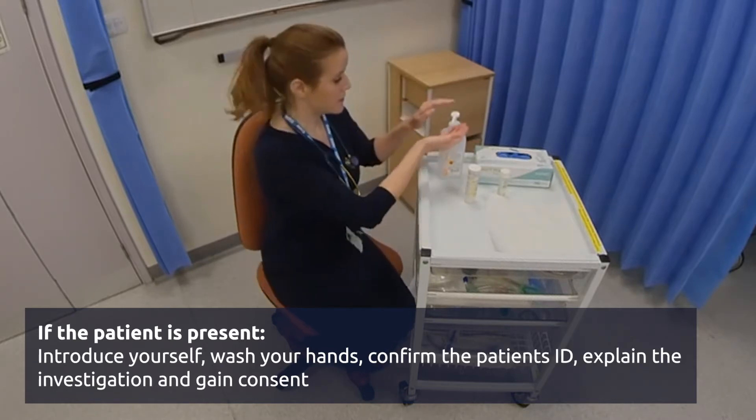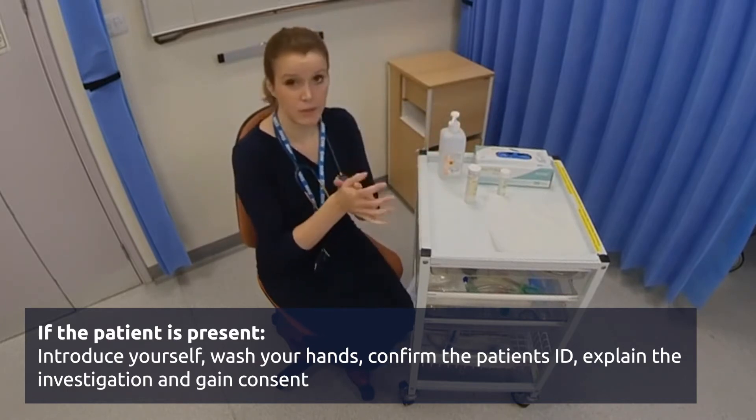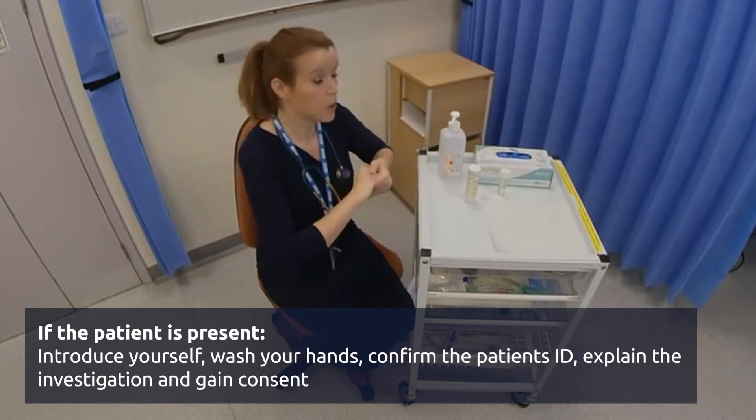So first of all, wash your hands, like in any procedure, and then pop on a pair of gloves.